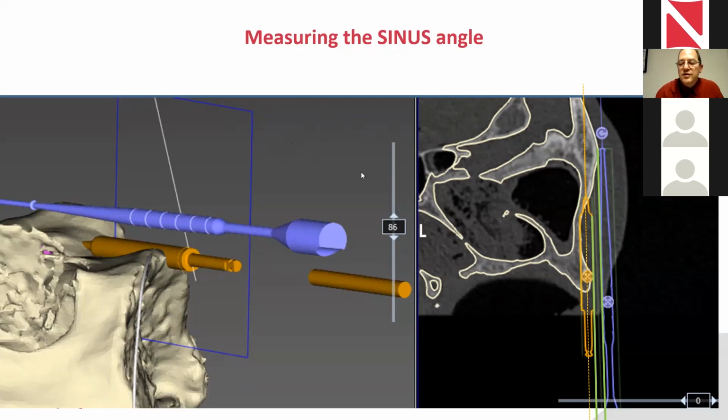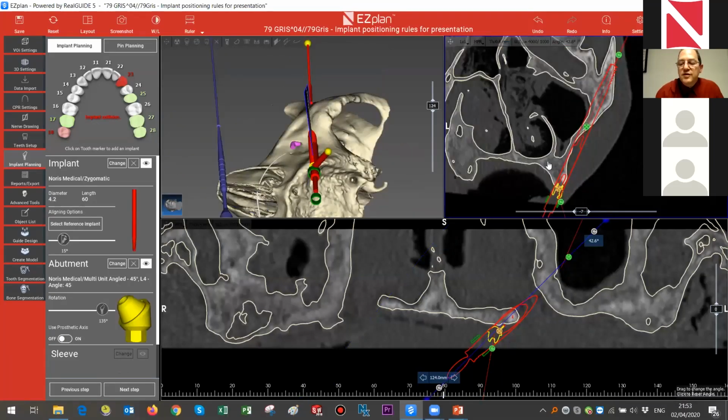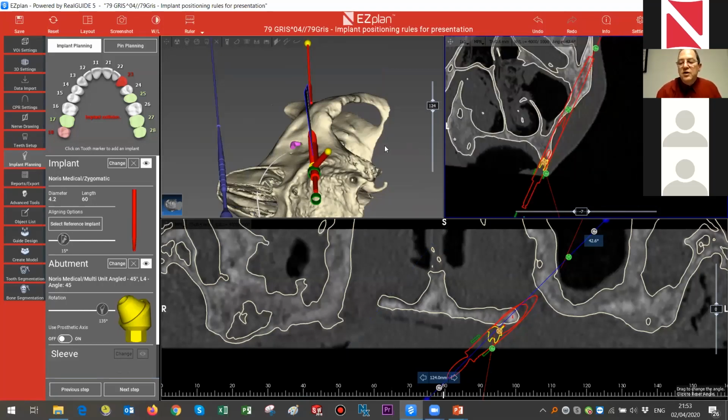Look at what we have. We have an implant. To understand what I said before, if you have software like this, you need to know this dimension. Very important. I cannot see this tool here, I cannot show it. Anyway, I will move the implant away. I'll hide the implant. So what we see here is the line where we want to be.